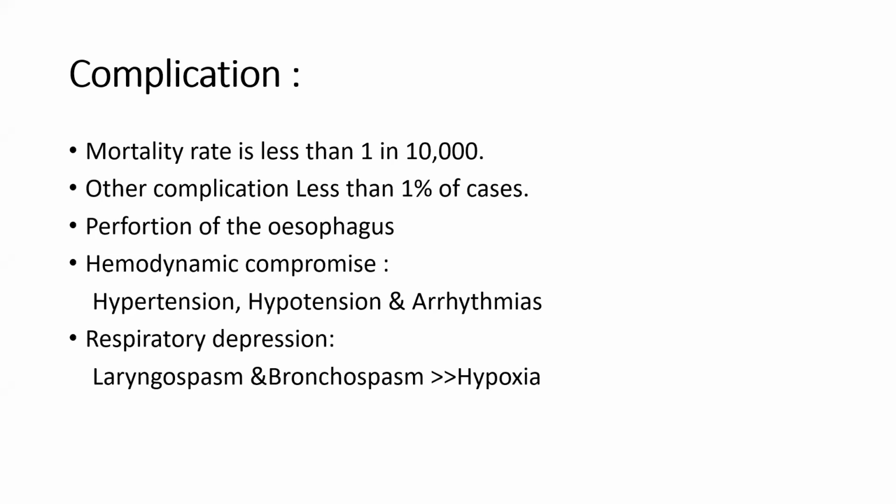Some patients, if they are not reassured by the doctor, telling him that this is a simple procedure, we'll give you sedation, I will introduce a small probe through your mouth to the esophagus, like a small piece, less than 1 centimeter, it will go directly to the esophagus, he will develop hypertension. He will be tense, and the blood pressure will go up. So if it goes up, it will be better for you, so you can give sedation comfortably.